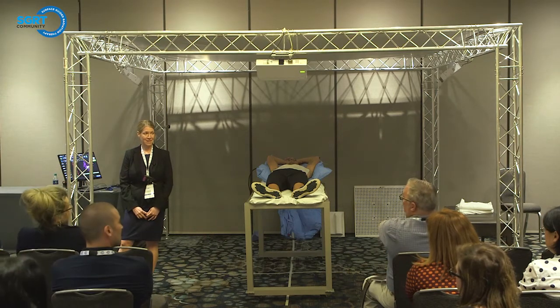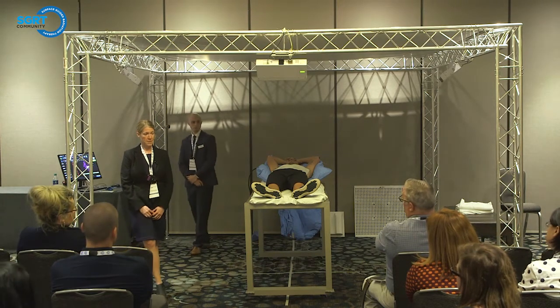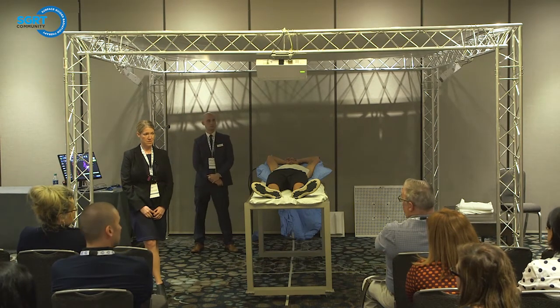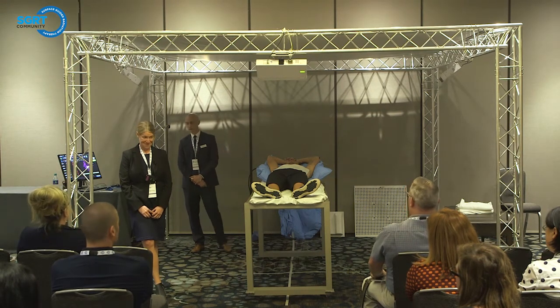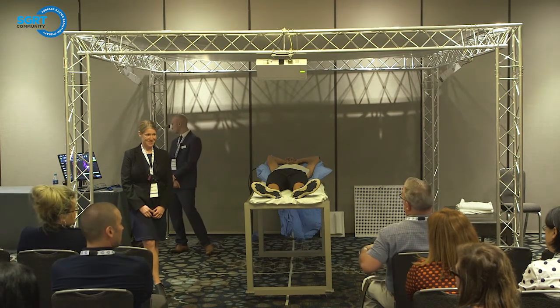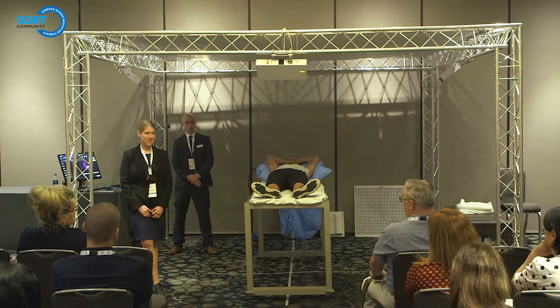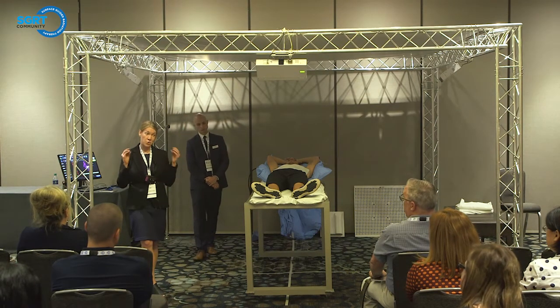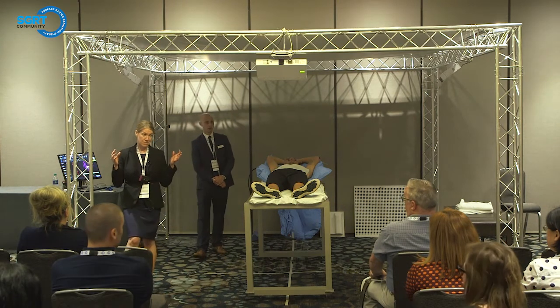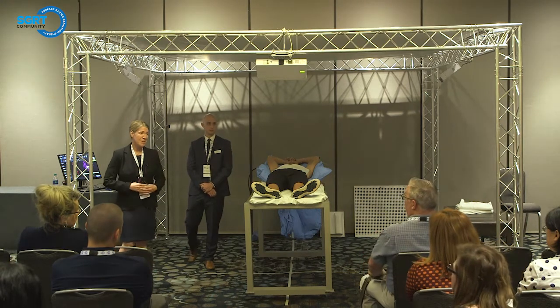What are some of your workarounds when the skin tone is too dark and it gets very hard for the cameras to read? People try to put a tissue or something flat on it to get those cameras to read it. Are there any other solutions? The first thing I would go with is to call service and have them come and adjust the apertures for the dark skin tone and open those up.